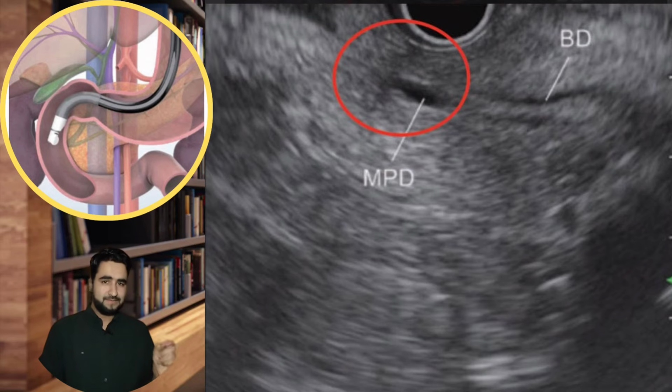Since here in the image, papilla is in the range of central beam, that's why you can see it in the central field. You can facilitate your observation by expanding the descending duodenum by injecting lukewarm water.